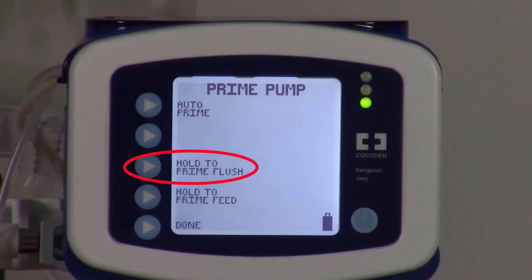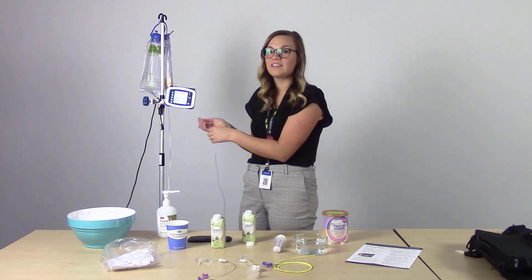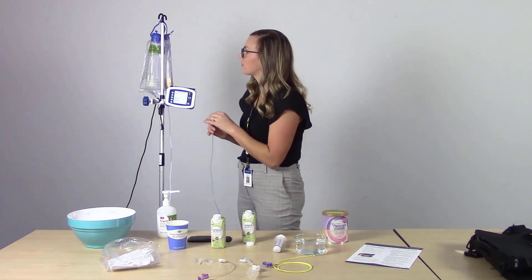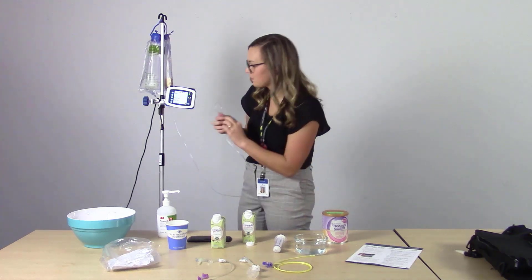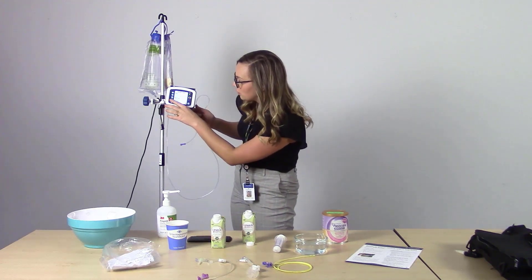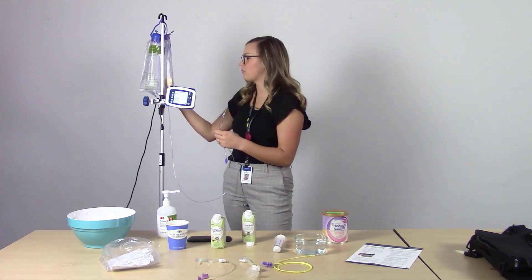The other two buttons are hold to prime flush and hold to prime feed. You'll manually hold these buttons and the flush will pump through the water or flush in the blue bag through the tubing. If you select hold to prime feed, you'll need to hold this down manually to pump the formula through the bag.